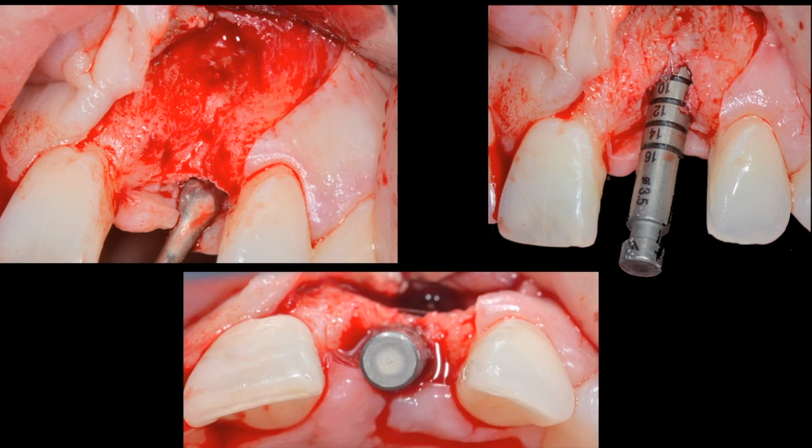The implant emergence has to be towards the palatal side, as much as possible towards the cingulum of the adjacent teeth. So if you draw a line in between the central and the lateral incisor, the implant has to come somewhere in between these two lines palatally as much as possible, to allow some soft tissue and for the ceramic to be able to hide that abutment from the soft tissue.